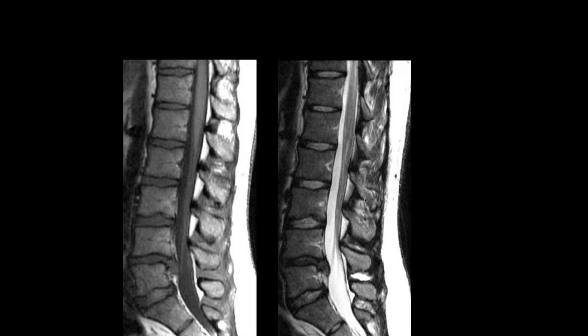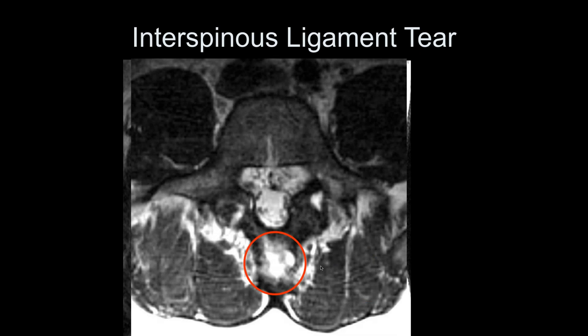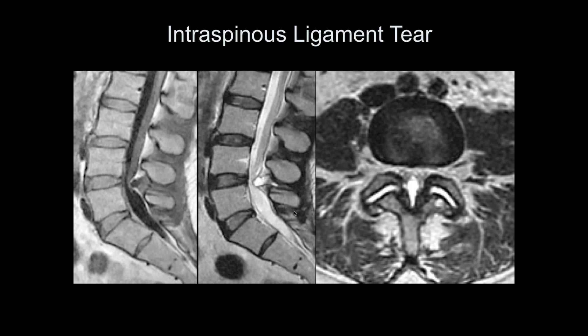There's some retrolisthesis of L4 on L5 and some disc extrusion. There is real edema in the interspinous area — if you get an accident right there, there could be a posterior distraction type flexion injury. Here's another example: an interspinous ligament with fluid going in and compressing the nerve root. And here's just another example with a big cyst coming from an interspinous ligament tear, again compressing the thecal sac.